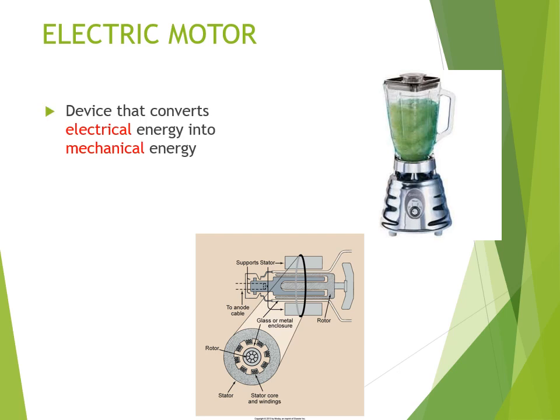A motor is something you would plug in, so you want to have electrical energy. An example would be to blend something where you have blades, and those blades are going to turn, so electrical to mechanical. The other example is the induction motor in the X-ray tube.